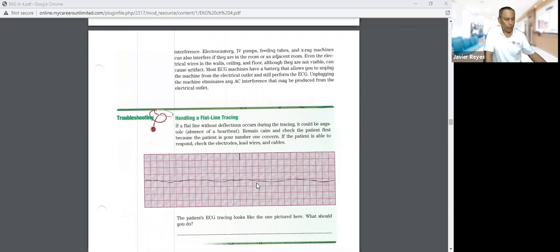And this is where we use the silver electrodes. When they're doing telemonitoring, you don't use 10 wires. In this case, we usually only use 3 wires. We're going to be using the white, the black, and the red. White, salt and pepper, and then the red.